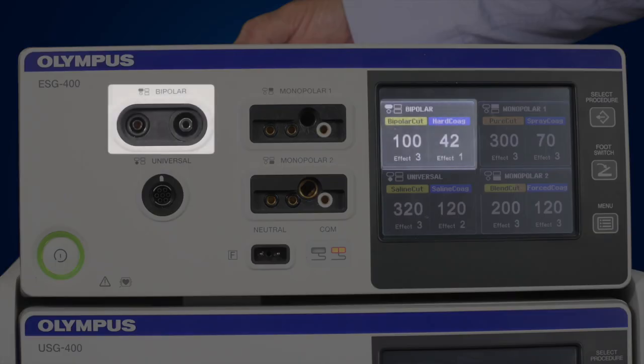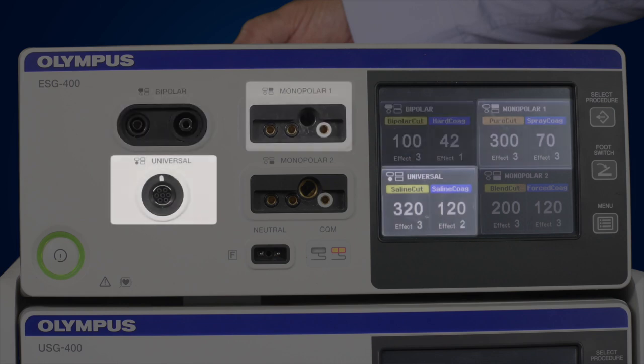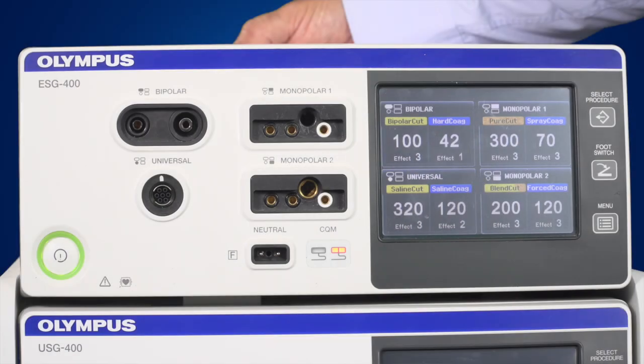The displayed quadrants correspond to the connection areas on the left of the generator. Each time the generator restarts, it activates the settings which were in use when it was shut down.